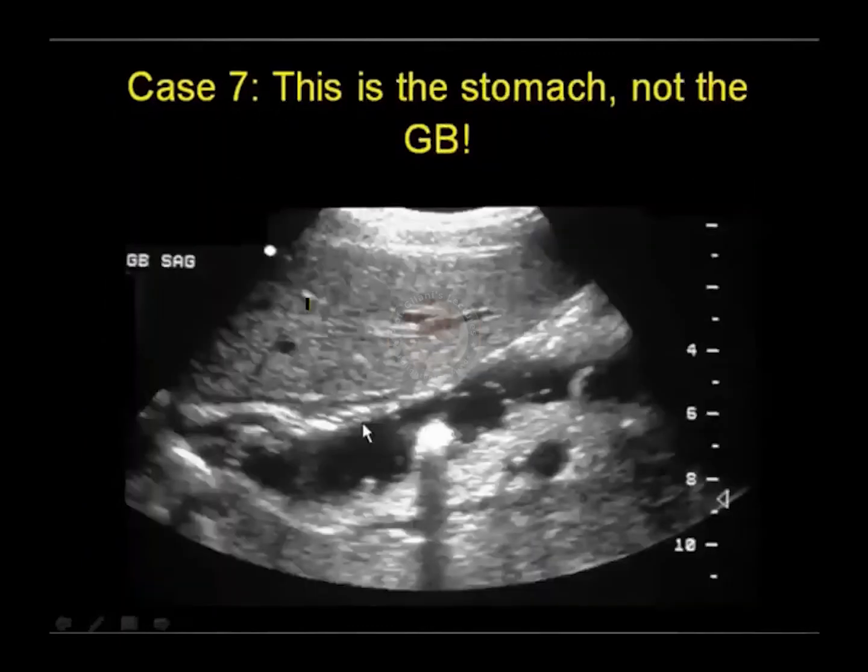There it is. That nearby structure was actually the stomach, which was mistakenly diagnosed as the gallbladder, and it was labeled as a gallbladder having a stone because the patient was having pain. Later on, when the patient was scanned, you can see the neck of the stomach and the pylorus, and here is the stomach on this side. So it was not a gallbladder.